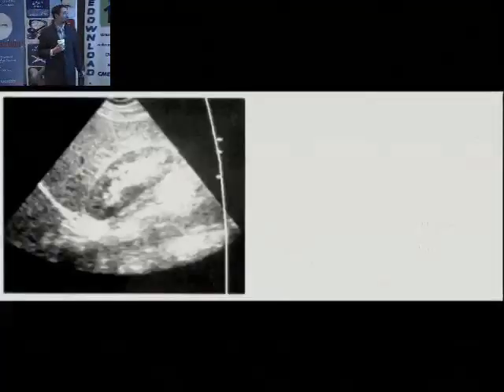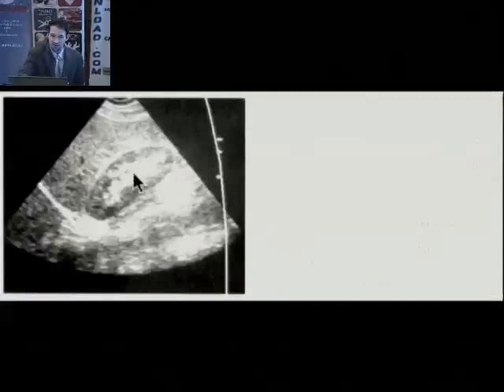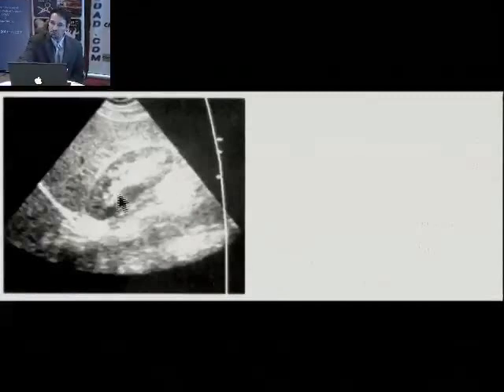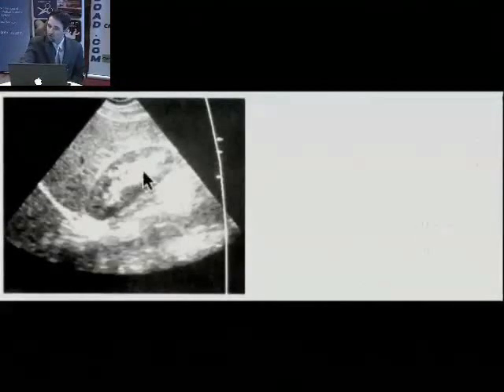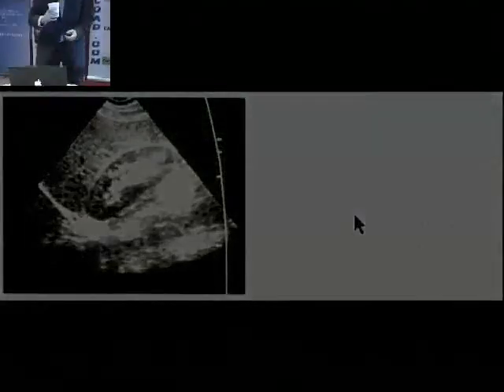Basic ultrasound anatomy of the kidney. Again, the gain is a little bit high here, but the center portion is this white renal sinus, which is mostly fat, and since it's normal, there are no black collections of fluid in there. The outer rim of it appears black. This is the inferior pole. This is the upper pole of the kidney. Liver and diaphragm right next to it.